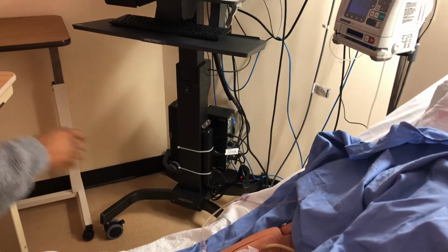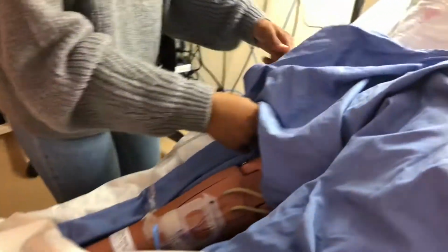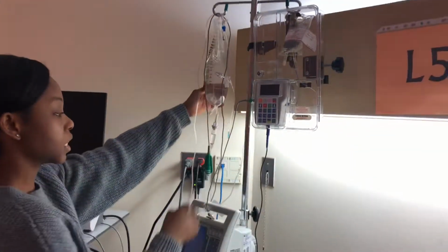So while I'm here, I'm just gonna make sure that the site looks good. And I see that there is normal saline already connected here, but it's not running. And normal saline is in the bag, which is patent as well.